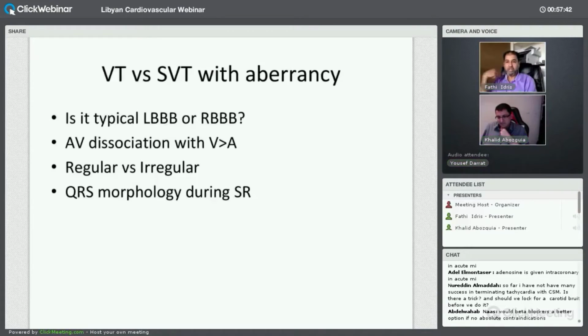So again, same thing. You definitely need to auscultate to make sure there is no bruit before you do carotid sinus massage. Put the patient flat. Make sure that you have the EKG machine running, so you catch the rhythm and you catch the effect of the carotid sinus massage, like the case I showed you earlier. And then I usually go with the right side, so use your thumb and put it just lateral to the trachea. Feel for the pulse. Don't press on the neck until you feel a pulse that's consistent with each beat.